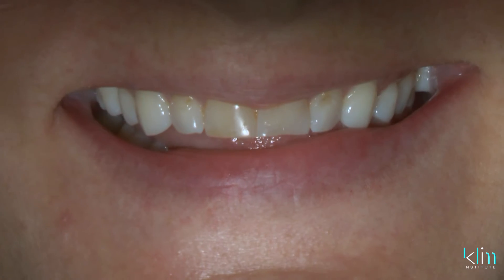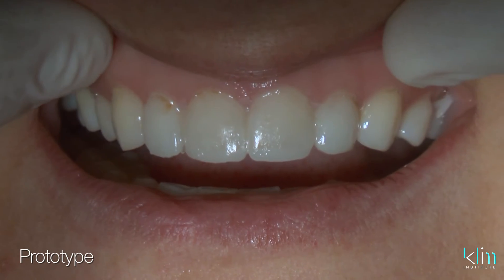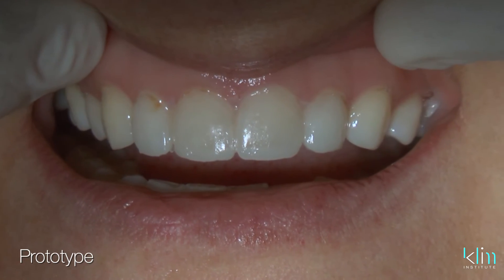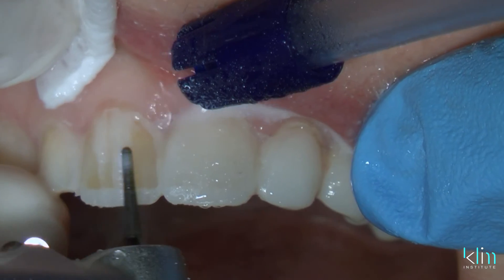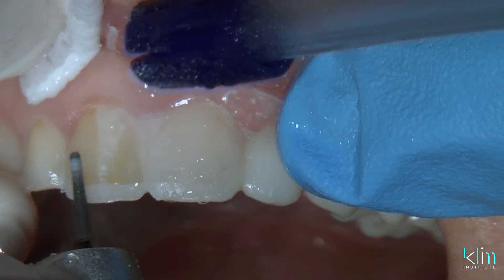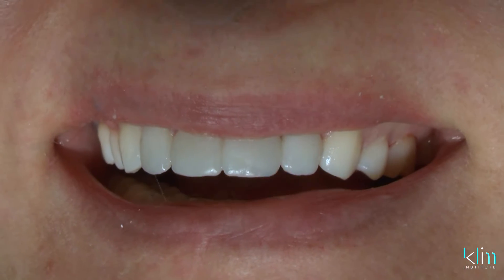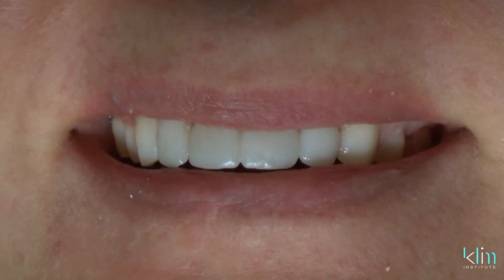Historically I've always used biocopy and I still believe in biocopy — I want to work the case up first, I want a prototype that helps me know how to reduce, and it will also help me with transitional teeth, which are provisionals, if I need them. Most of my anterior cases I don't do in the same appointment, and there are reasons for that.